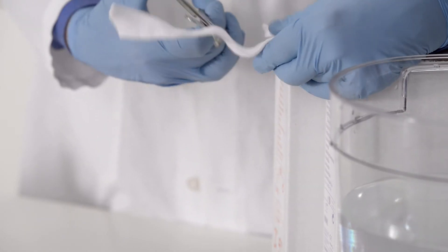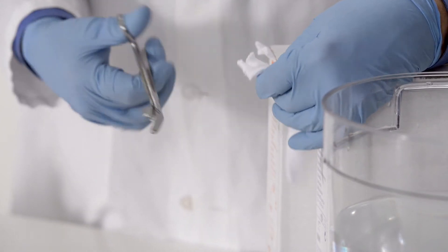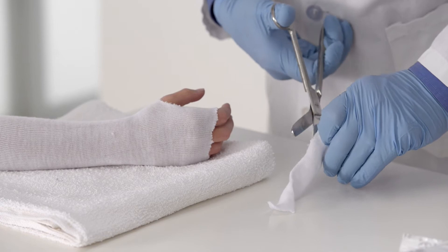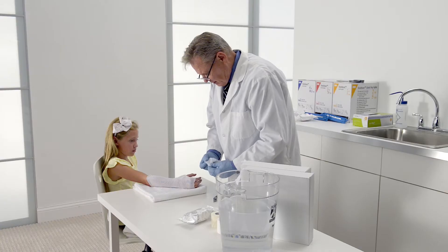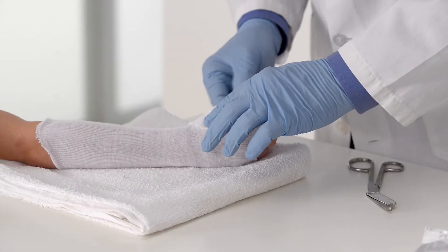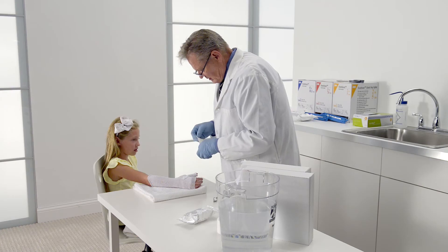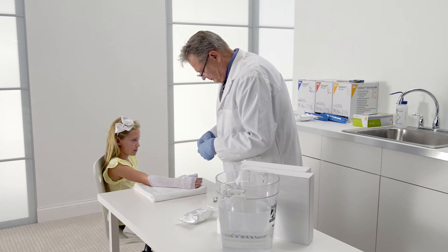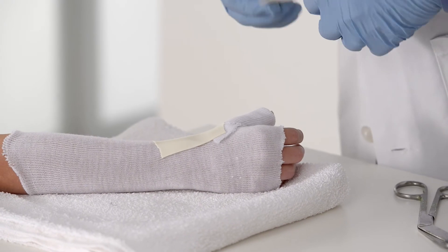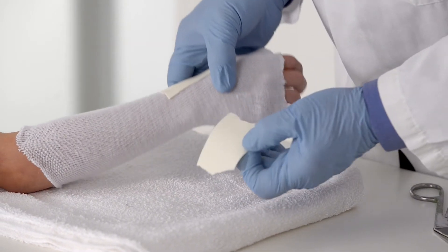Next, cut a piece of short 1-inch stockinette. At one end of the stockinette, make a 2-inch longitudinal cut. Slide the stockinette over the thumb and ensure the tip of the thumb is visible. Using a piece of 3M micro foam tape, secure the 1-inch stockinette to protect the wrist. Fold the excess inch of stockinette back over the thumb to create a padded collar at the base of the thumb. This will protect the thumb after the cast is applied.